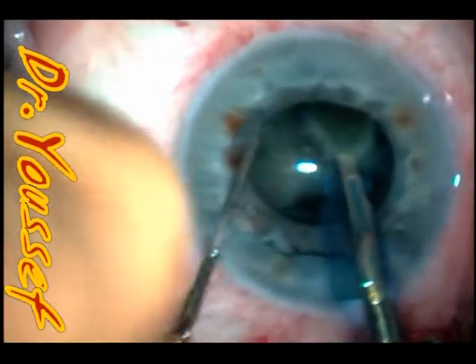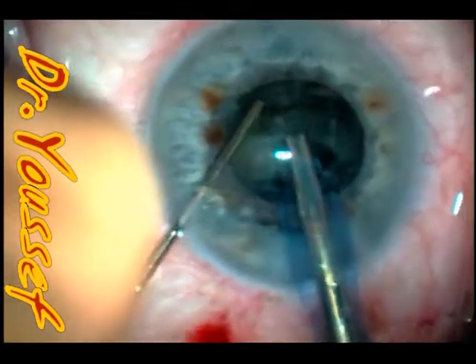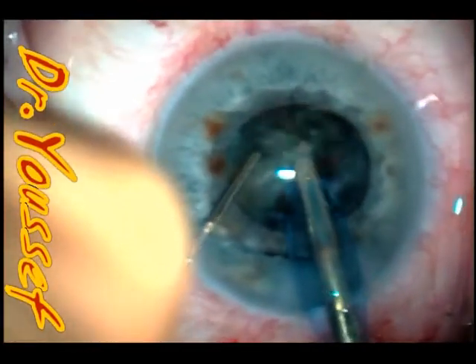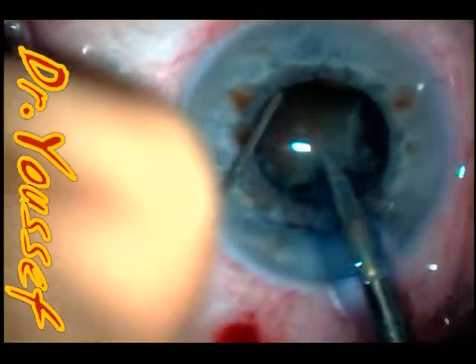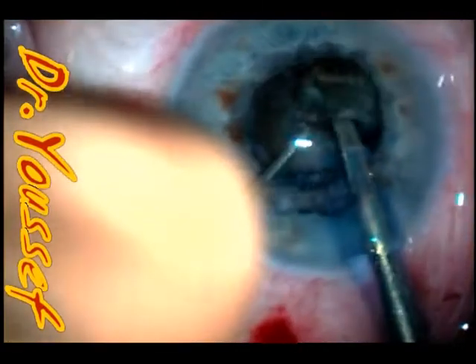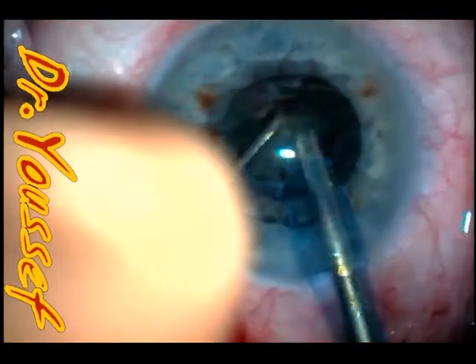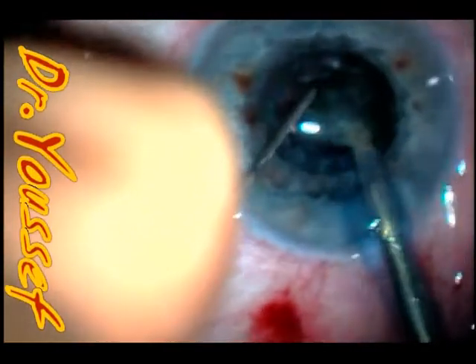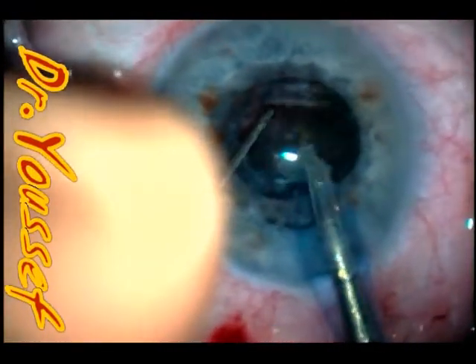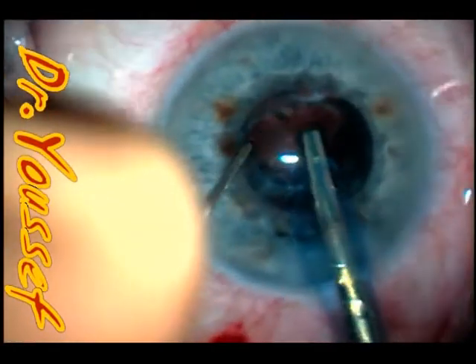You can see I'm doing very slow phaco, just making sure that there's no stress on the zonules during the procedure, and staying away from the pupil. I use a lot of chopping rather than phaco — my phaco powers are very low and mostly it's mechanical breakdown, and the phaco just removes the pieces out of the eye.